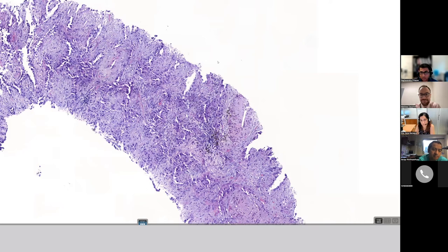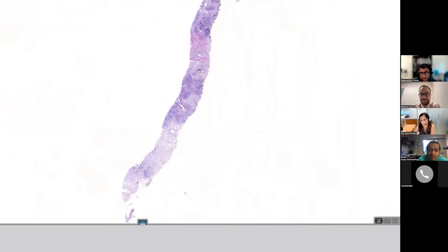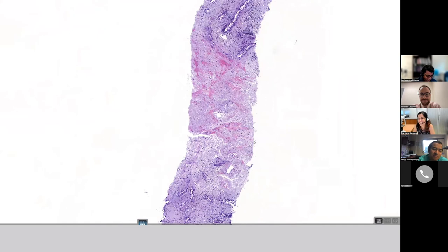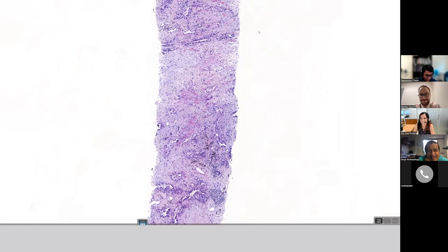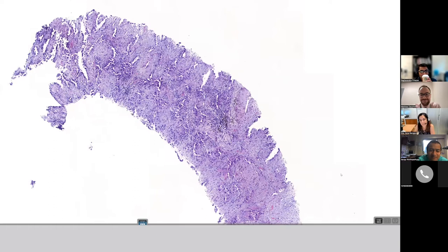If I'm going to do NGS, I have to say the percentage of tumor that I have here. How much tumor would you tell? It's a challenge. We all know, Irene, this is not a science. It's just a guess, right? So, yeah, I try to ballpark it. Is it half and half? In this case, I'm trying to think, is it half tumor cells and half non-tumor cells? Or is tumor more than non-tumor? I start with that and then I progressively refine my guess.